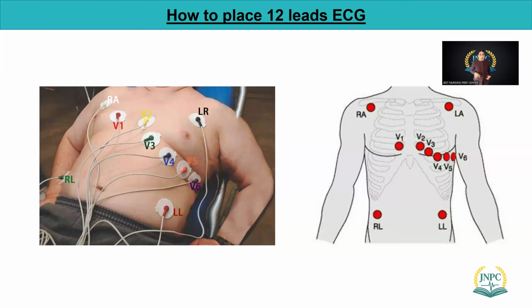But one thing you need to make sure of is that we are exposing our client. So privacy is going to be very important. We are exposing, so make sure that you give enough privacy to the client so that they can sit comfortably. They shouldn't be getting panicked. Let's say if it is a female, sometimes they're uncomfortable. So make sure you give them comfort. That's a very important part of nursing. Do not judge, do not do anything, give them comfort. If possible, close the curtains and then do your part, okay?